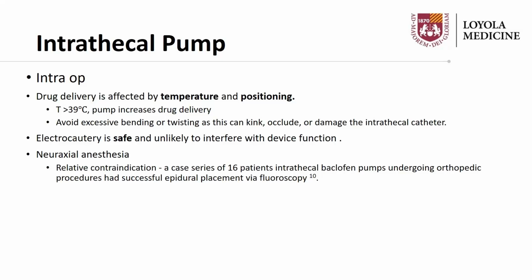prior review of imaging. And although this is challenging, I found a case series describing the successful placement of epidural catheters in patients with intrathecal baclofen pumps. For this study, 16 patients undergoing planned orthopedic surgery received epidurals placed under fluoroscopic guidance on the day of the procedure, and the pumps were interrogated prior to discharge with good outcomes.